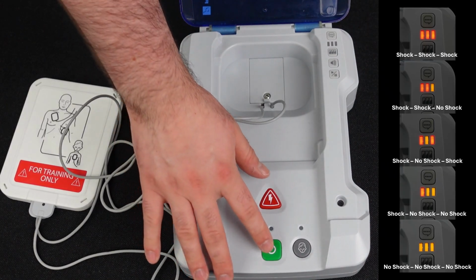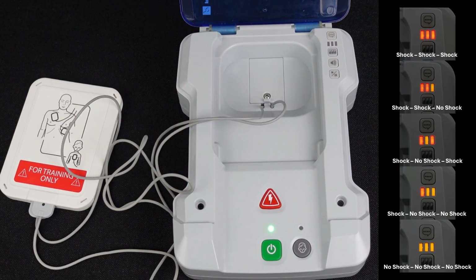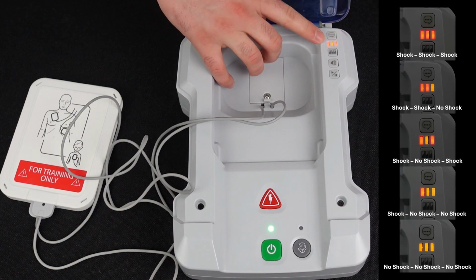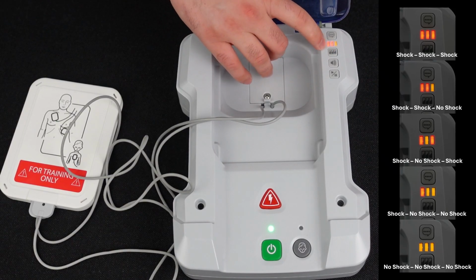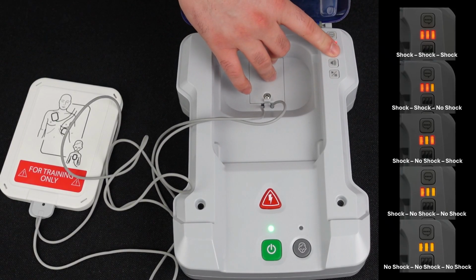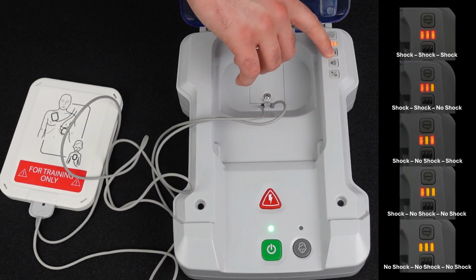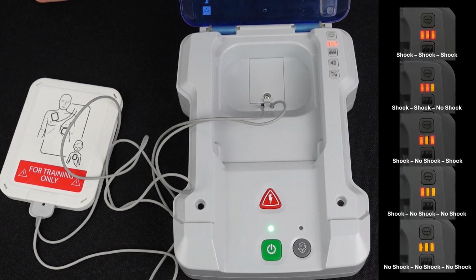To change the training scenario, turn the AED trainer on and click the scenario selection button. There are 5 scenarios to choose from as indicated in the picture to the right. Red means shock and yellow means no shock. Once the scenario you want is selected, you can turn off the AED to save or continue to change other settings. The volume button allows you to choose between 3 different volume settings.